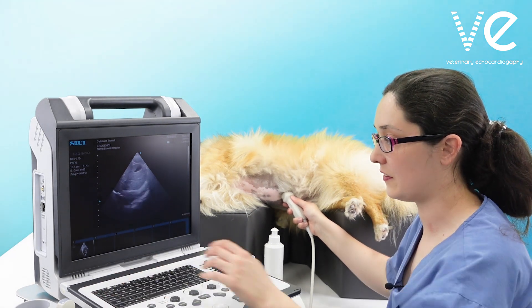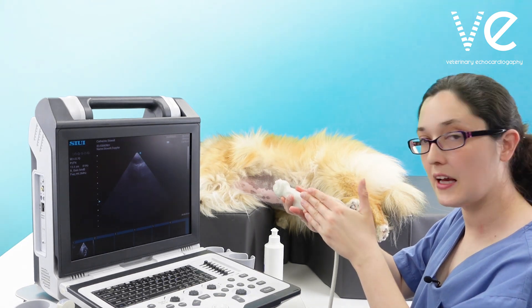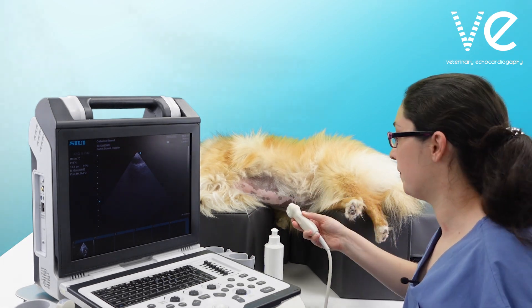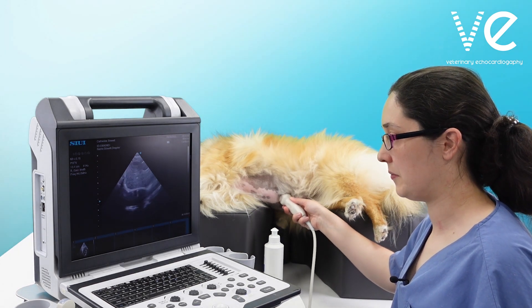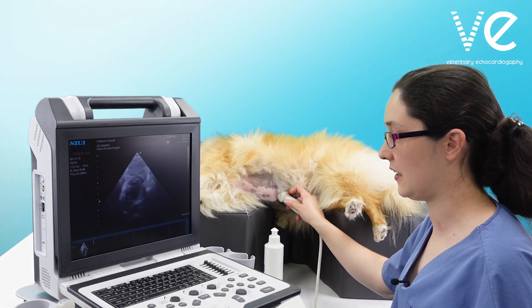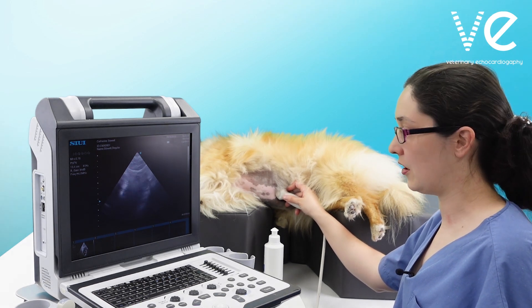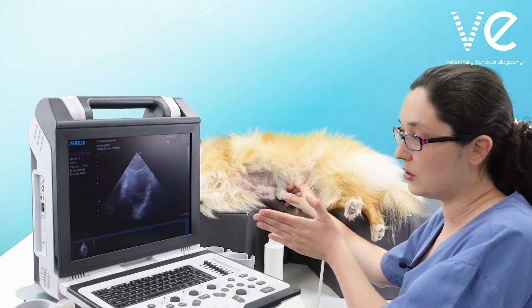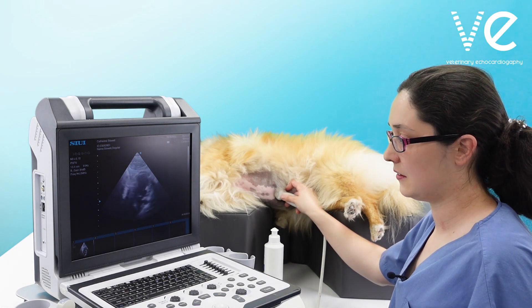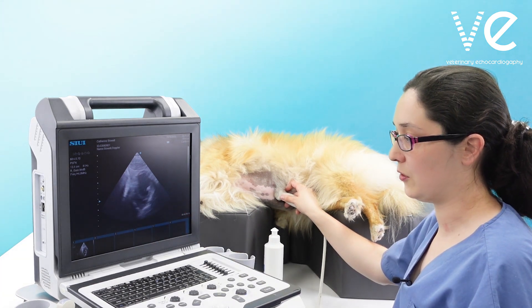The first thing I see is the liver — that means I'm in the right place. I'm going to change my alignment now so that the tail of the probe is going flatter towards the dog and the head is going more cranially. Tilting, I'm getting the heart in view. You might have to adjust your hand position so your hand doesn't get in the way. If you make it too flat an angle you'll lose the valve and you'll just get the two ventricles — left and right ventricle. In that case, tilt back until you see that bright white line of the aortic valve.